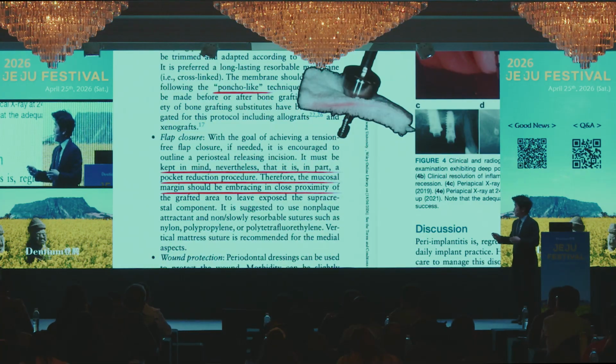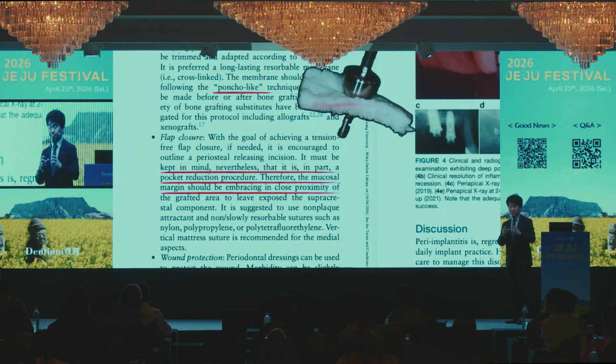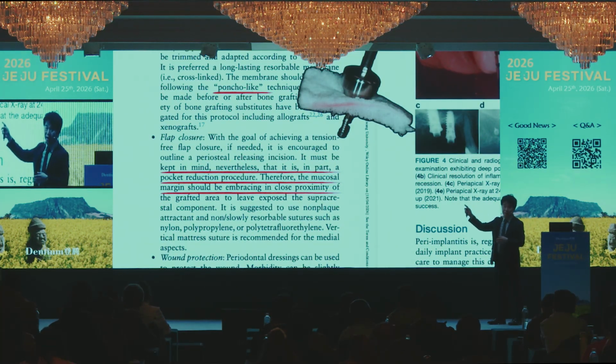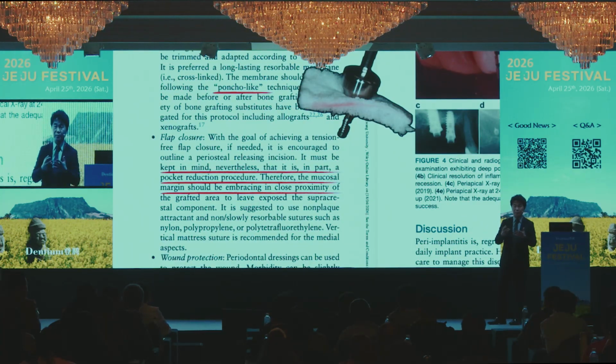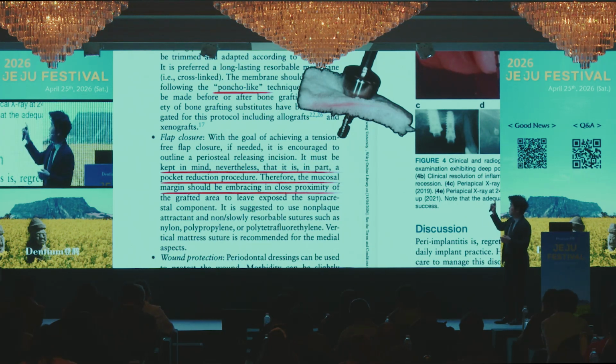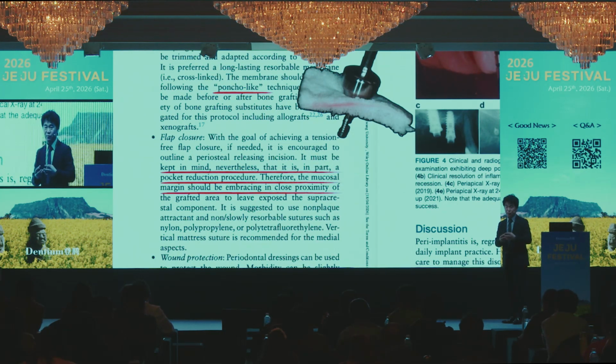Anyway, it is such as the immediate implantation. The peri-implantitis defect always penetrates the transmucosal part, as you know well. So a poncho-like technique is needed. At that time, the collagen graft X1D is very helpful.